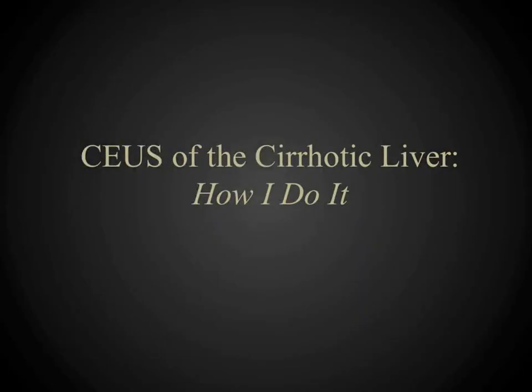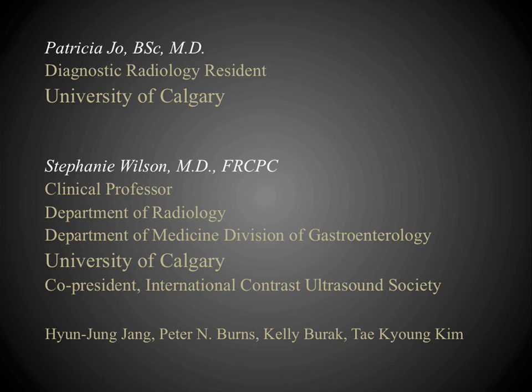This How I Do It video is on contrast-enhanced ultrasound of the cirrhotic liver. It is produced in the ultrasound department at the University of Calgary.